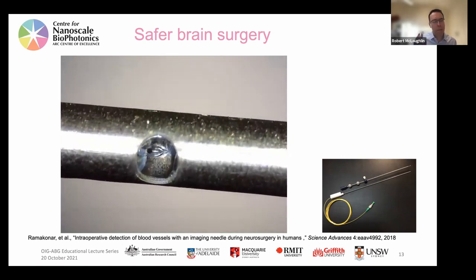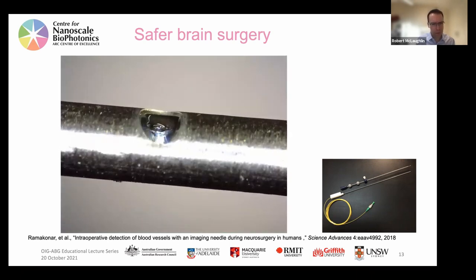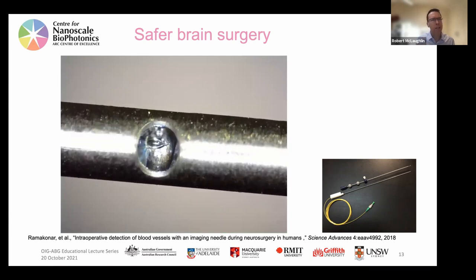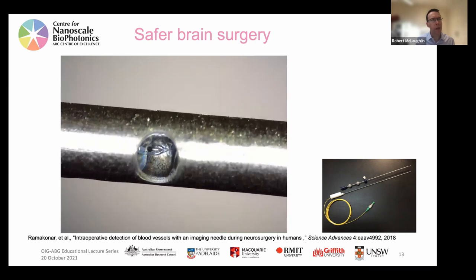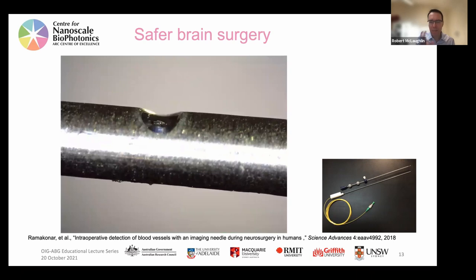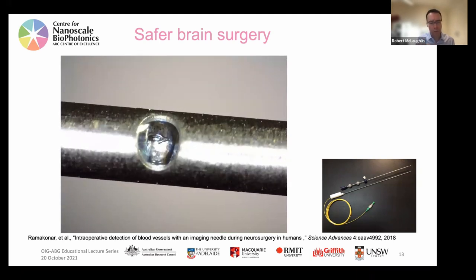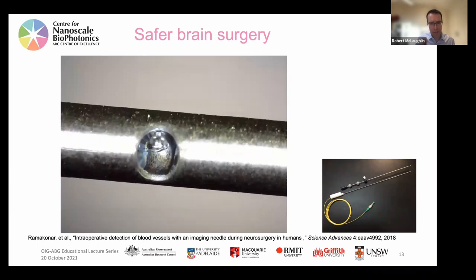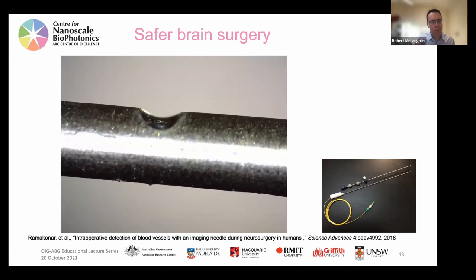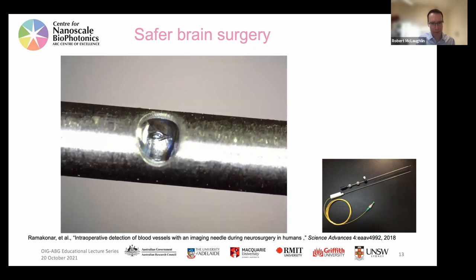I might point out, bigger needles aren't actually necessarily easy to work with. We often work with sort of 24 gauge needles, so it's about 640 microns outer diameter, 0.6 of a millimeter. So that's about the size of a needle if you're going traveling and you're going to have a vaccination, or if you're having any vaccination these days, that's about the size of needle you'd have, and that's what we often work with. With these large needles, one of the challenges you've got is actually putting such a small fiber probe in the middle of such a big needle. And because we can only image over a small distance, you've got to make sure it's really close to the edge. So there are complications with working with big needles.